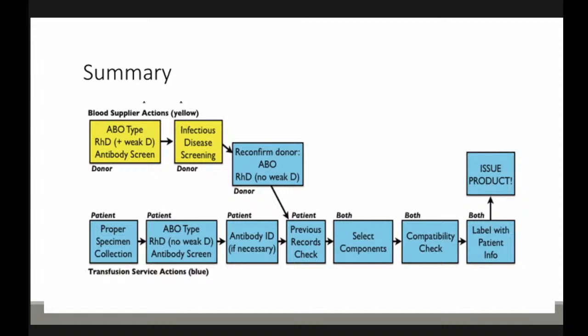We then receive a sample from the physician or the ward from a patient. We do antibody screening, and if we find the antibody positive, then we would do antibody identification.